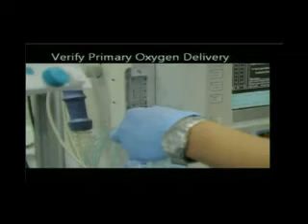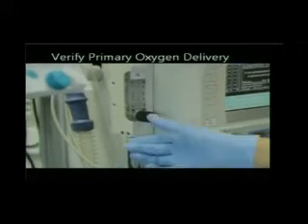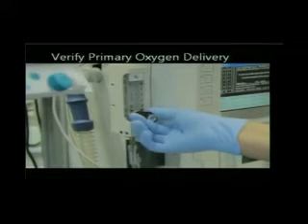The slide is entitled Verify Primary Oxygen Delivery. Yes, thank you. So oxygen delivery is key. And we have multiple sources in the operating room of oxygen. This right here is oxygen for a sedation case that will come through nasal prongs. And what you do is you have to see that, is it hooked up? Does the plumbing work? The anesthesiologist is responsible to be sure that this works. So, if you continue, please.